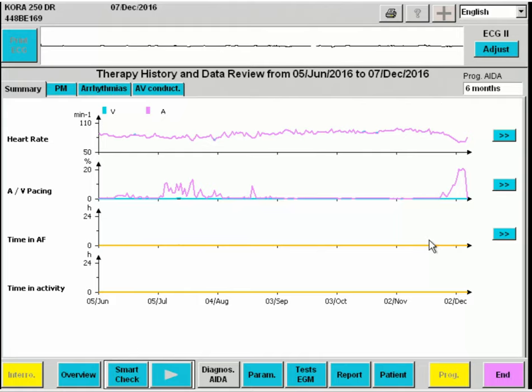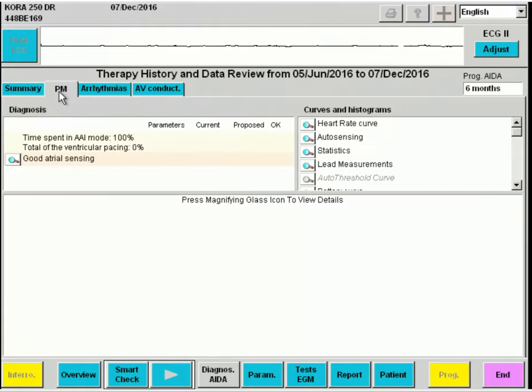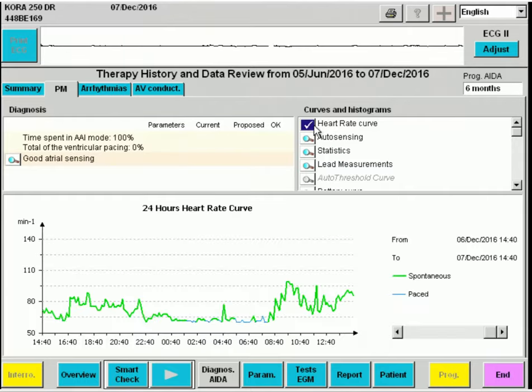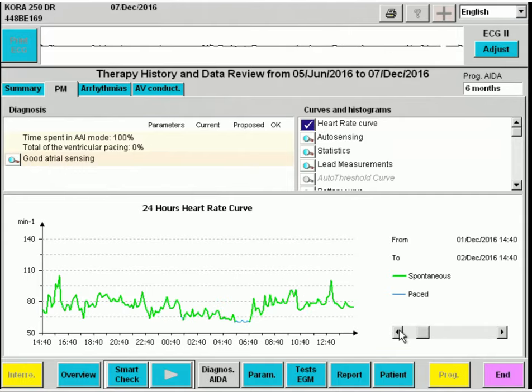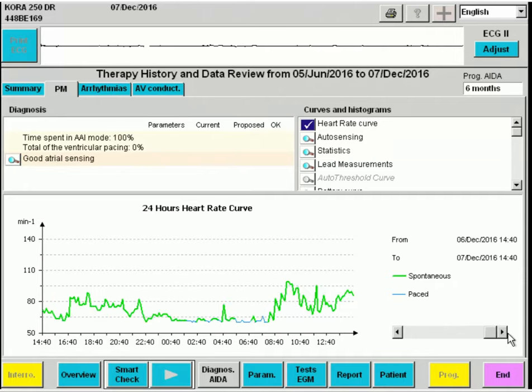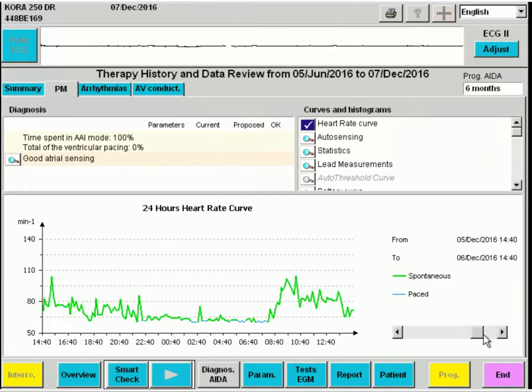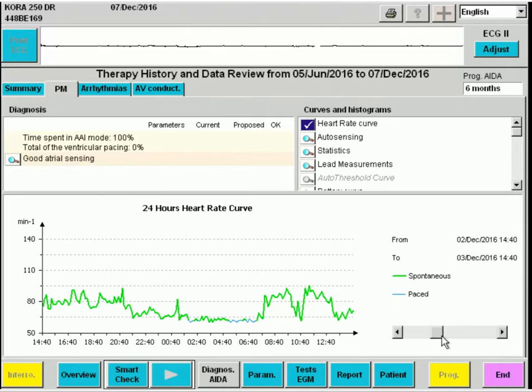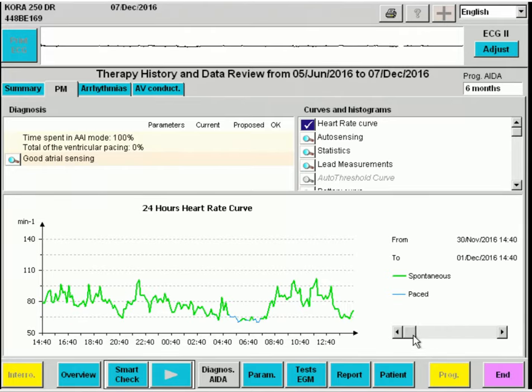We perform a systematic evaluation through the device recordings by working through the tabs. We proceed now to Pacer PM. When we select heart rate curve, we can see day-by-day curves of the patient's heart rate — in green the intrinsic rhythm, and in blue the paced rhythm, which in this case is atrial pacing.